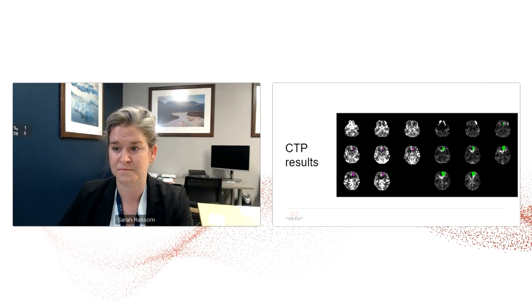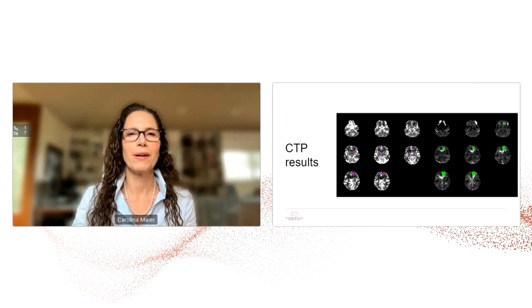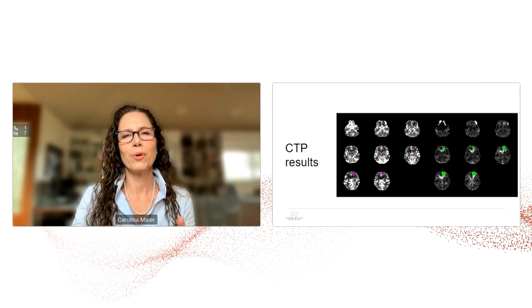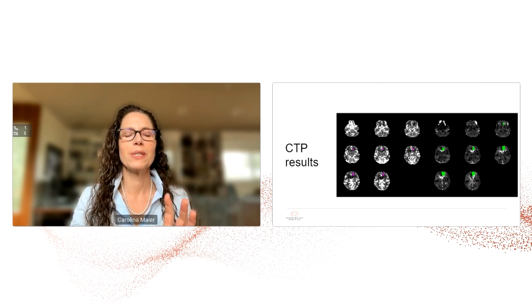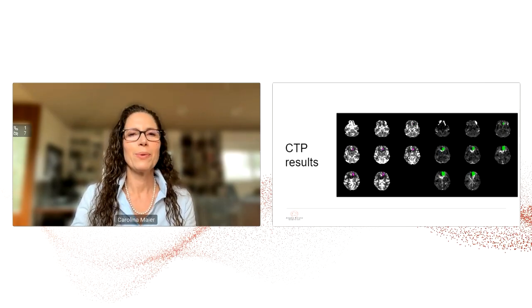Well, this was an excellent discussion, and I hope that our audience really learned the importance of image interpretation and actually looking at all of the maps in perfusion, and also the challenges, right? The pros and cons of using just clinical symptoms and the need to do some imaging to really help you hone in on the right diagnosis. So I think we're going to move on next now.